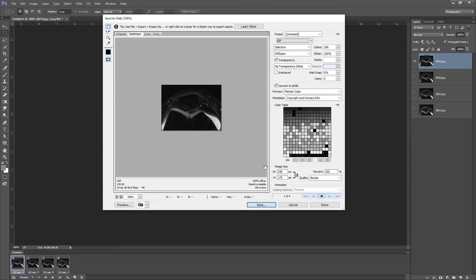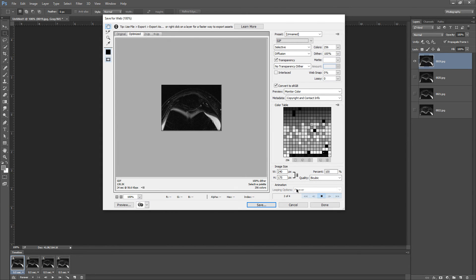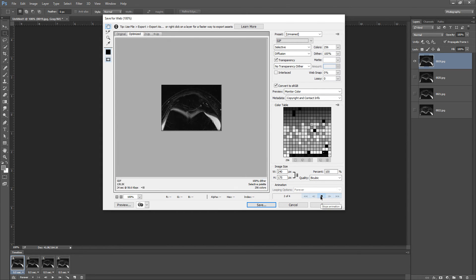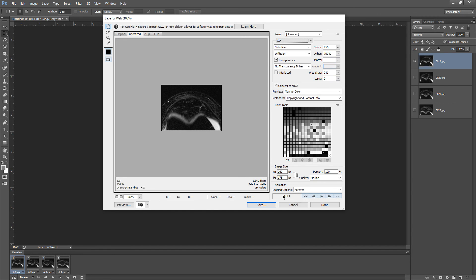I always just play the animation one more time, make sure it's cycling the way it's supposed to. Make sure it's looping forever. Otherwise, if it's set to once or three times, it's going to do it a couple times and then all of a sudden the animation stops and you don't know why.